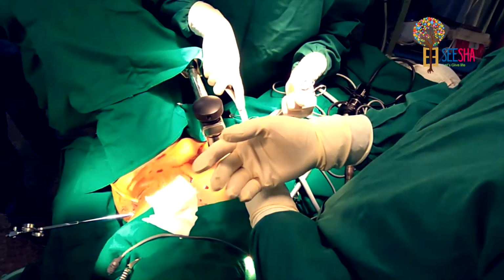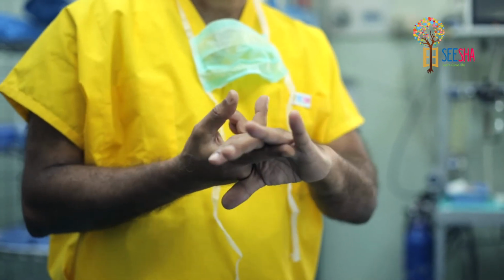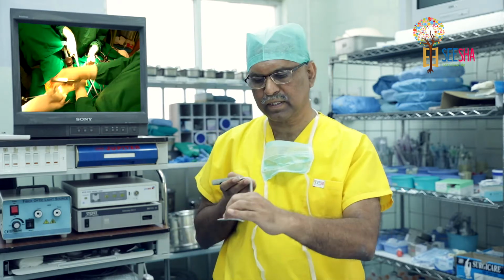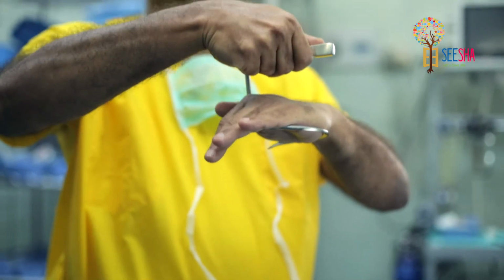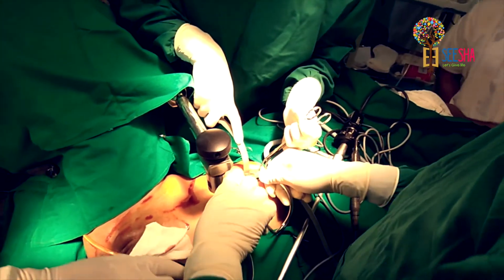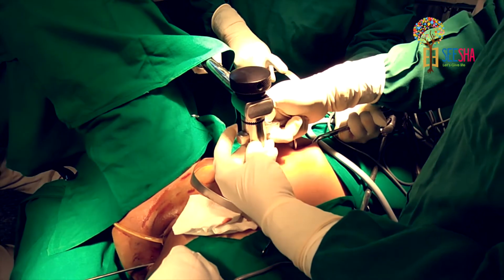So what we do is we put an index finger and sweep all around the umbilicus to make sure that there are no adhesions and there is no bowel or intestine between the abdominal wall and the apparatus. Then we use this special apparatus which we have designed to pass into the incision like this and lift the anterior abdominal wall. Once again we pass the finger to make sure there is no intestine between the abdominal wall and the device. We can also confirm it by using the telescope. So once this is done, the abdominal wall is lifted and held in position.